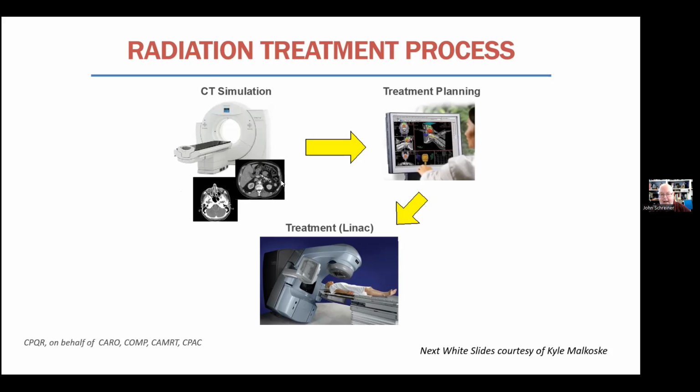A CT scanner is giving you a map of the attenuation coefficients. So the map of the probability of the interactions occurring in space. And so this is a map of a particular physical quantity, how well the X-rays interacted as they were traveling through. That's a map in space that gives me anatomical information. But in fact, this is giving me information of how well X-rays interact with the patient as they're going through.